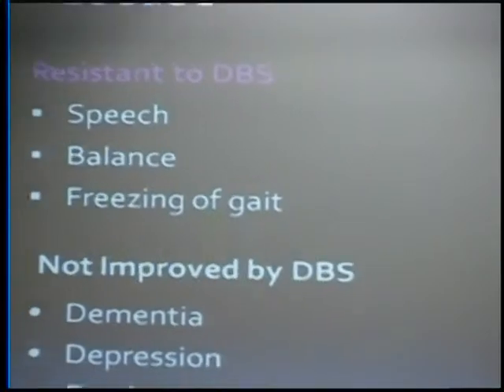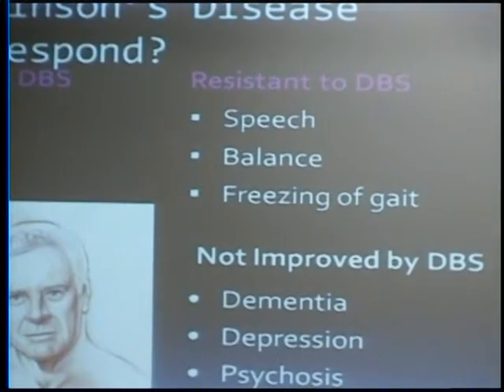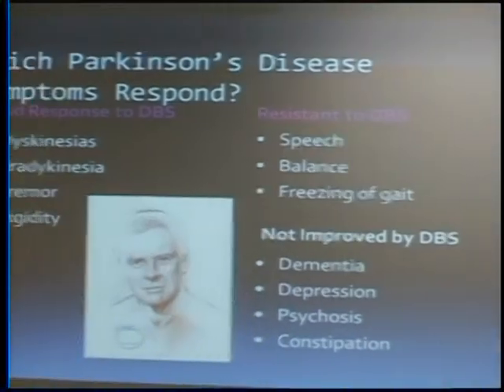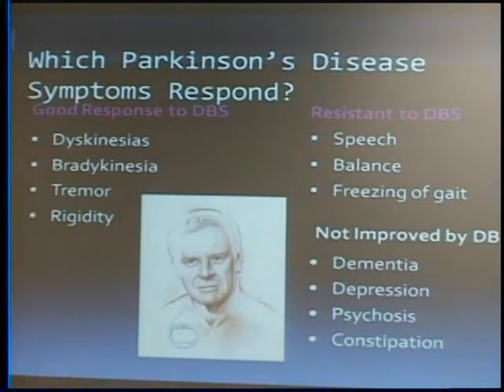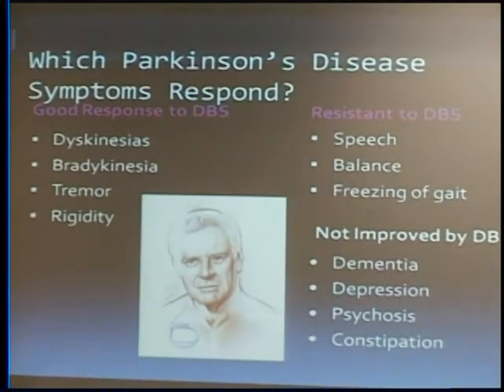But if we look at what responds well to DBS, slowness of movement or bradykinesia, tremor, rigidity, dyskinesia, those things we feel that with a good candidate, a well-placed lead, and then proper management of the programming and medicine, we should be able to get very good response in. And the nice thing is, for many patients, that holds for years and years, the response in those symptoms. So you can expect a good response in these symptoms with DBS.